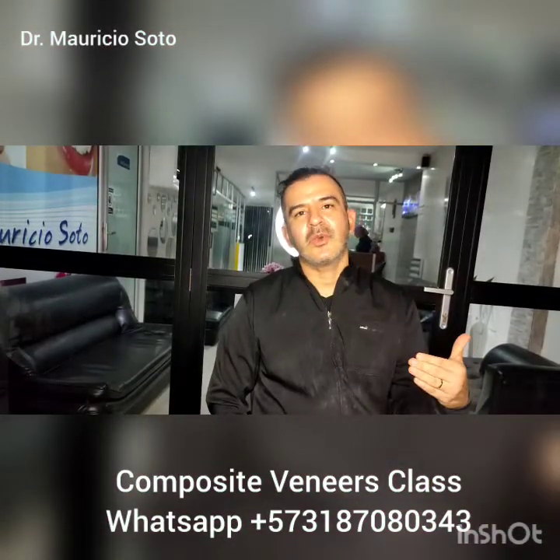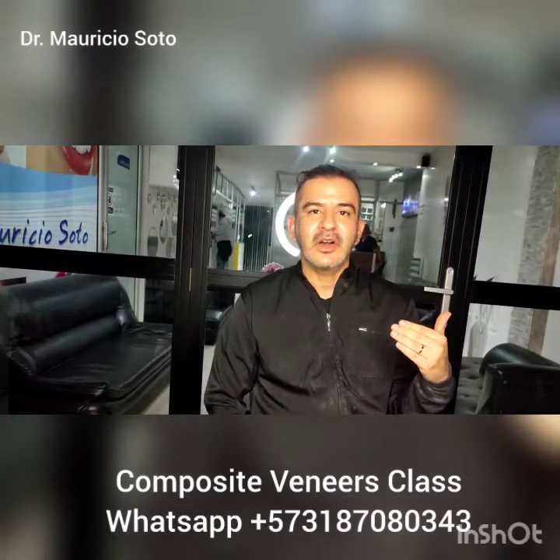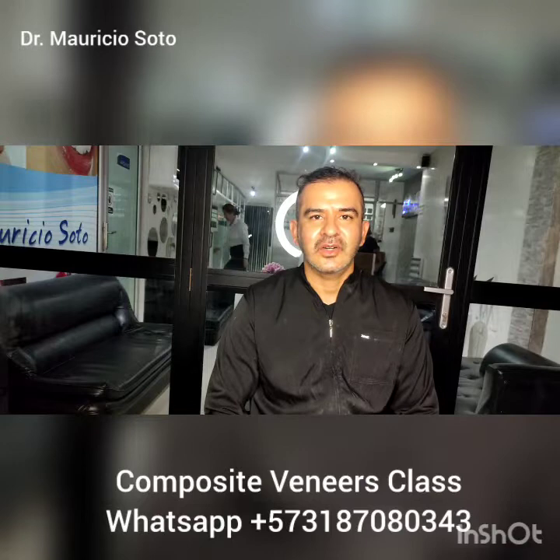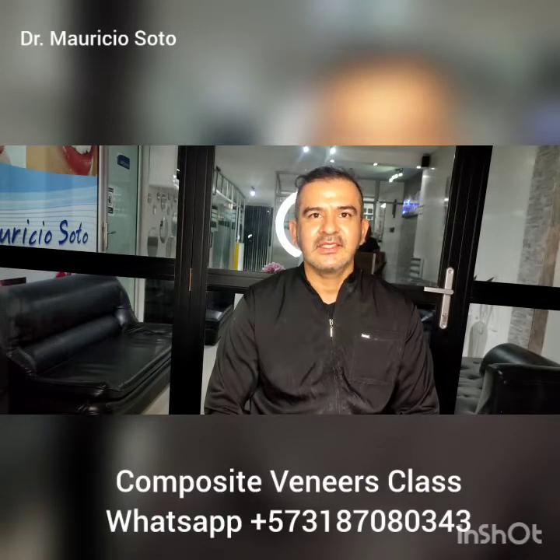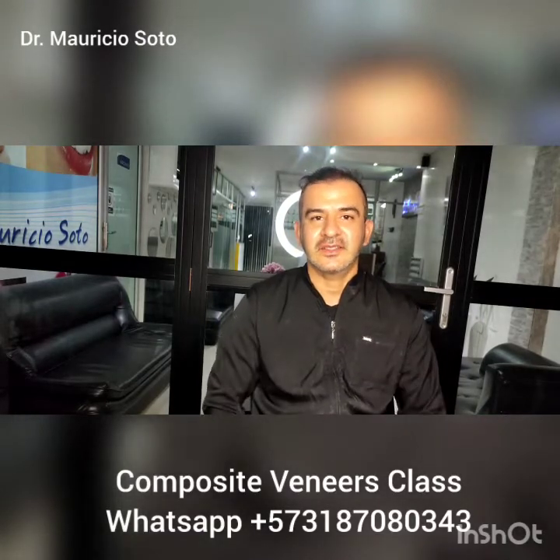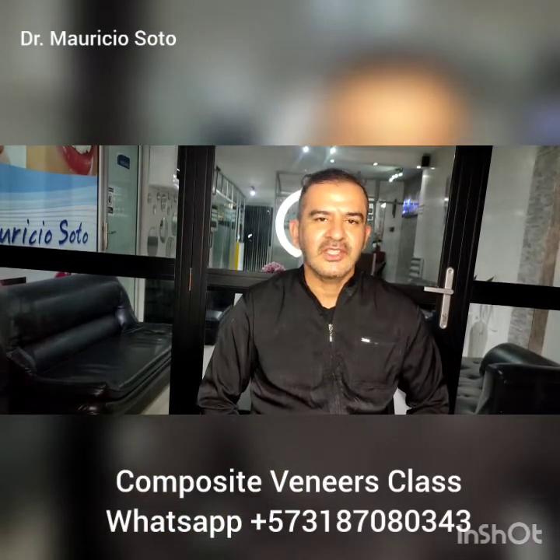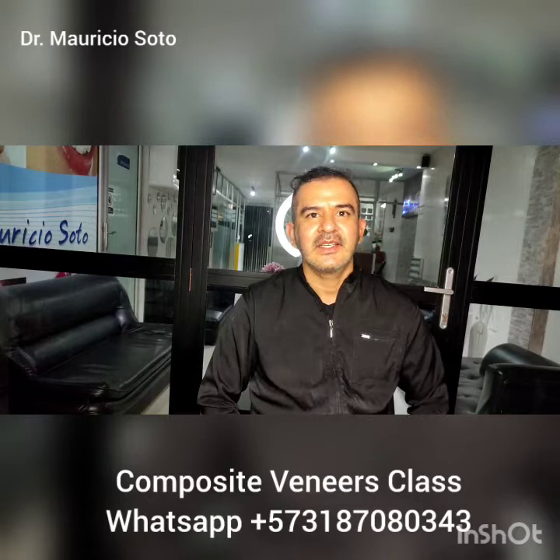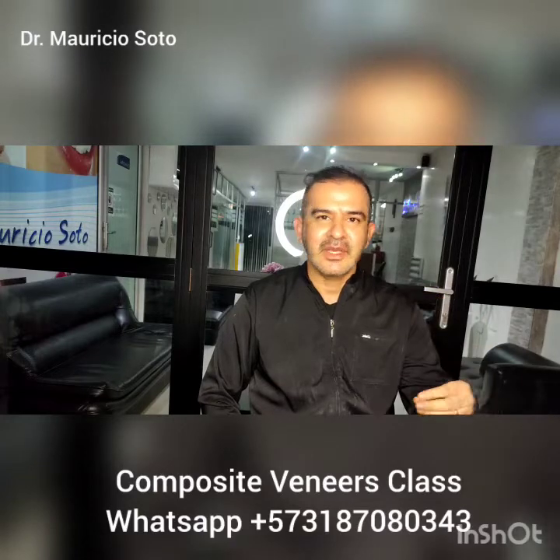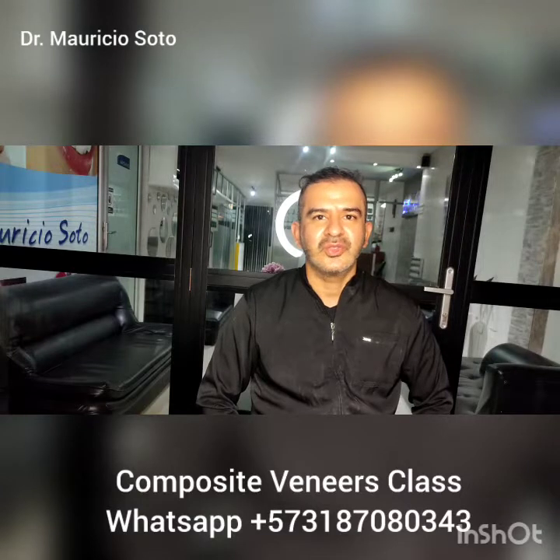After the pink wheel, I use the white wheel of the Diacom system for obtaining the shine of the veneers. It's important — remember that the natural teeth are shining, have high shine, and you obtain this with the white polishing wheel. Remember, more time means more shine. Spend time — 10 minutes, 15 minutes — shining the surface of your veneers.